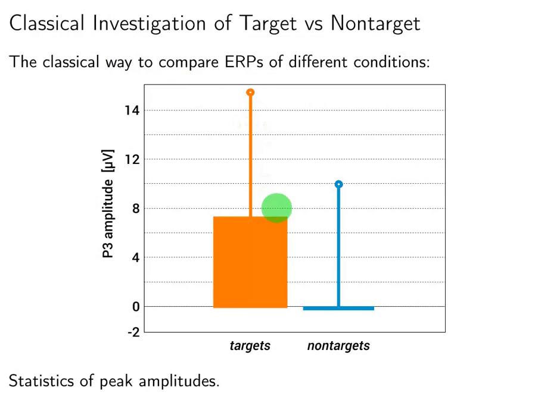The distribution of ERPs is also different. If you analyze target and non-target related ERPs, we have the following statistical values that correspond to P300 amplitude, the mean and then variance. You can visually see that they are very discriminable. Usually, these features are fed into a classifier, and then the classifier detects whether the data or segment of EEG corresponds to intended target or non-target.